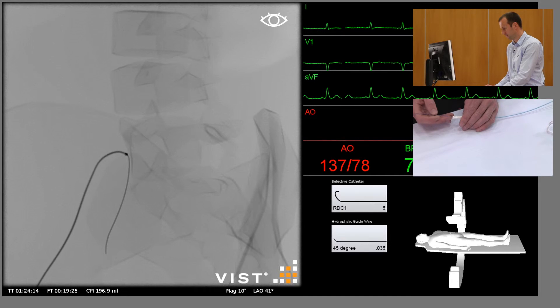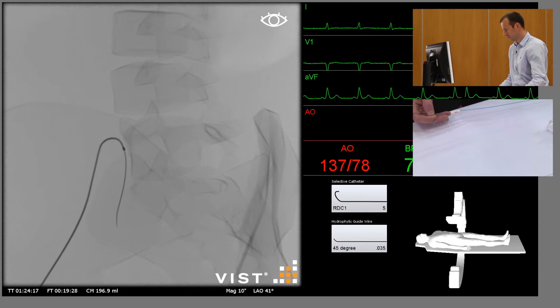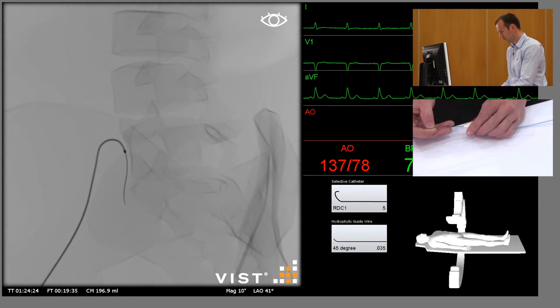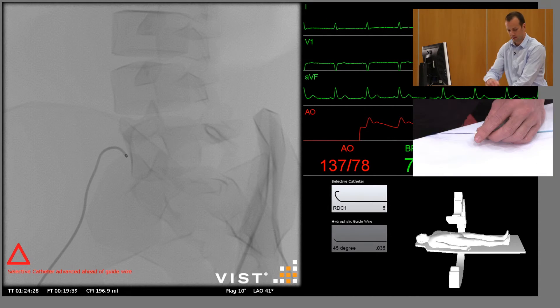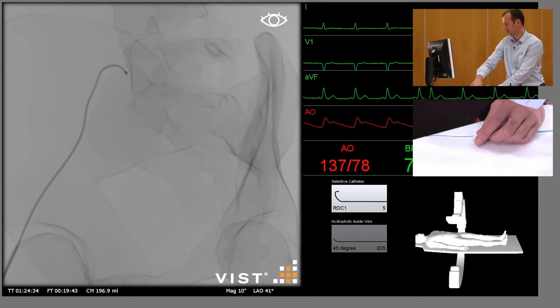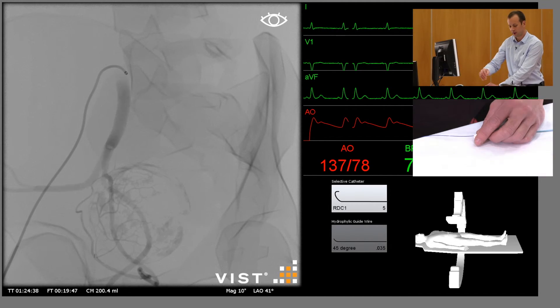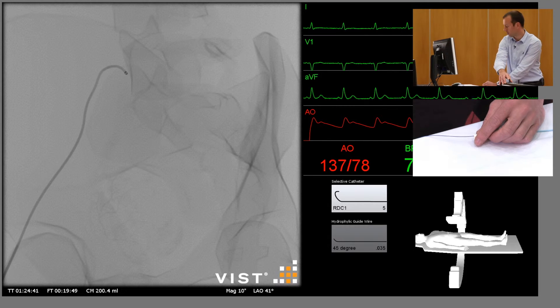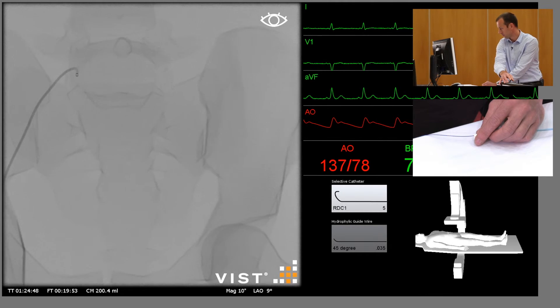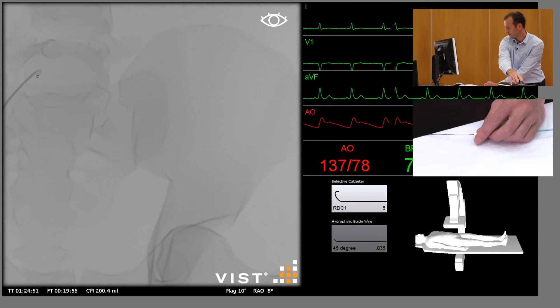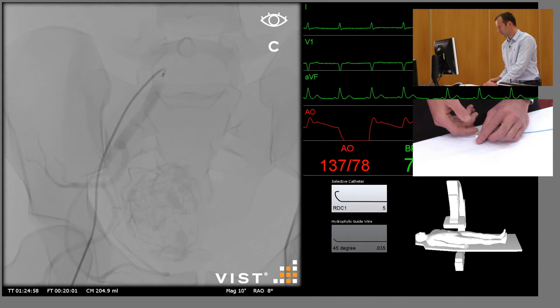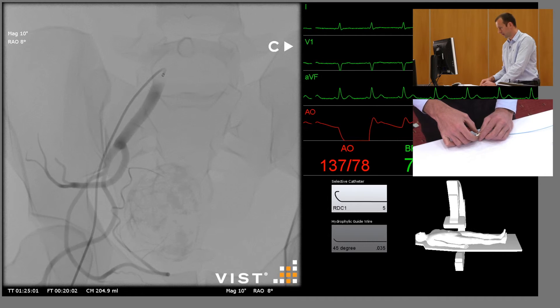I may need a little bit more wire. Centre south again, just confirm our position with a little injection of contrast. And this time we want a right anterior oblique to open up the bifurcation between the anterior and the posterior divisions. Perform an angiogram here. And there we can see a large uterine artery arising from the anterior division.